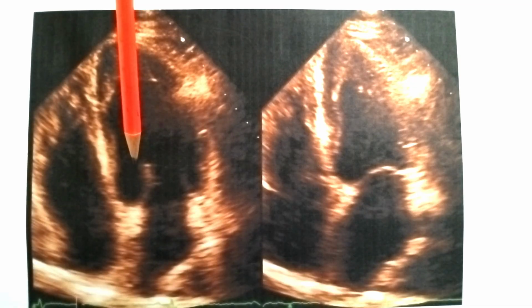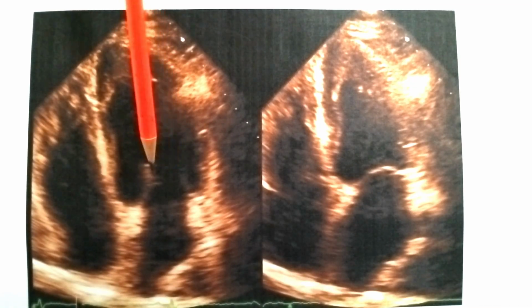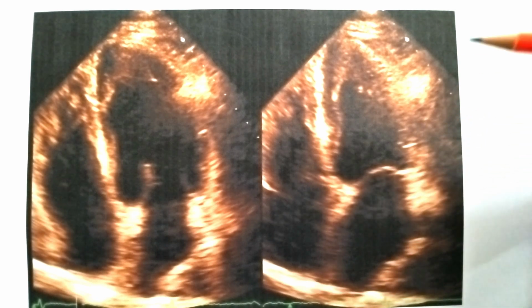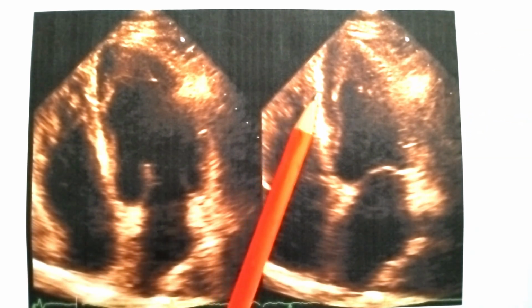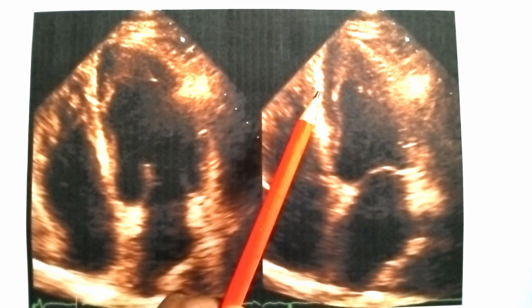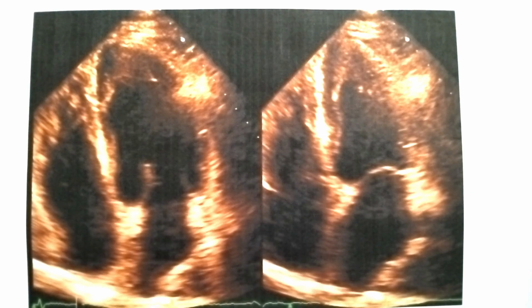Here you can see the mitral valve in open position. Mitral valve is in open position. Here mitral valve is in closed position. This is the easiest way for a lay person to understand. This is right ventricle, right atrium, left atrium, interventricular septum, interatrial septum.